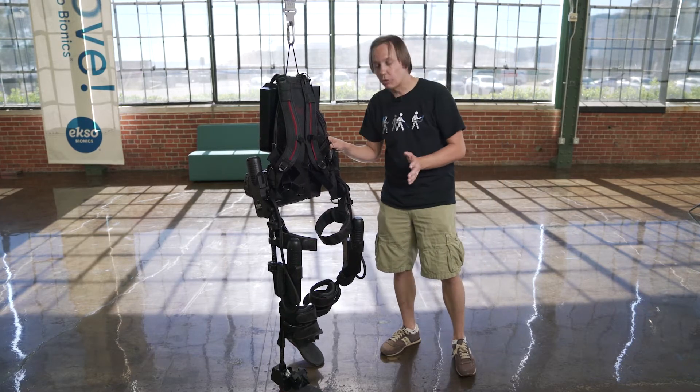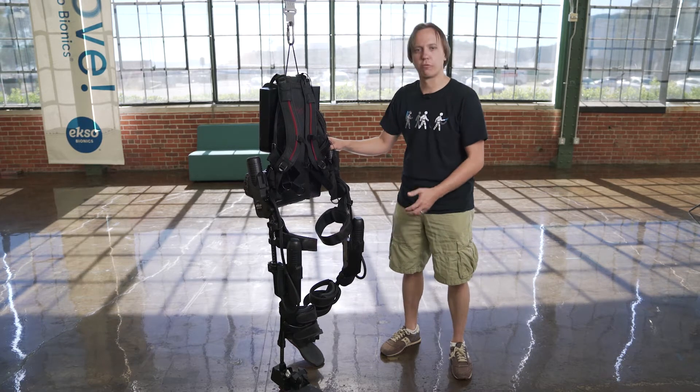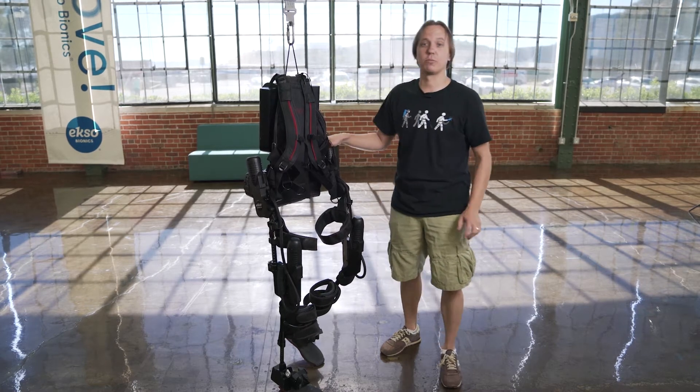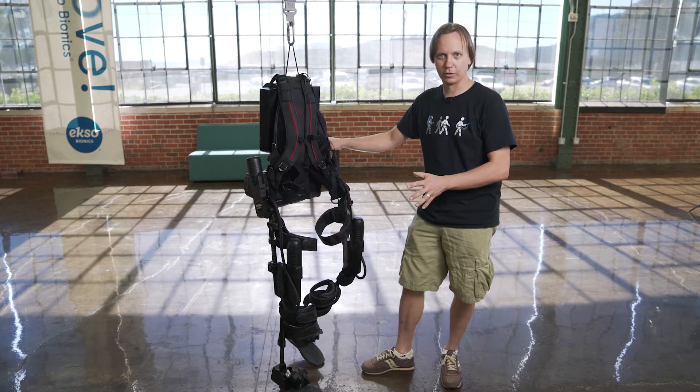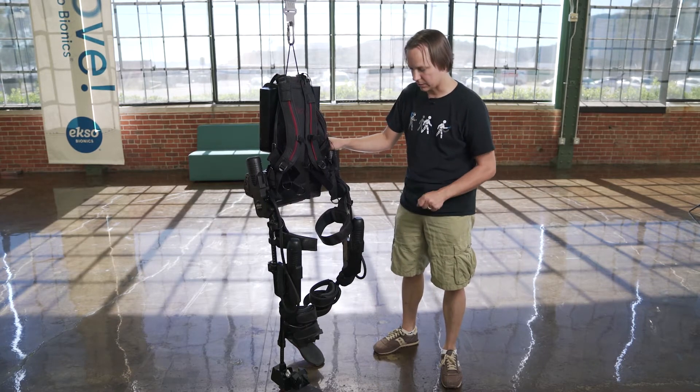From a technical point of view, what makes that so interesting is it's actually kind of hard to get a robot not to do everything for you. Robots just want to do everything — they want to do it perfectly every time. That's what robots are good at. So actually teaching the robot to back off a little bit and let the person work, that was a really hard thing to do. It took the engineers a long time here.